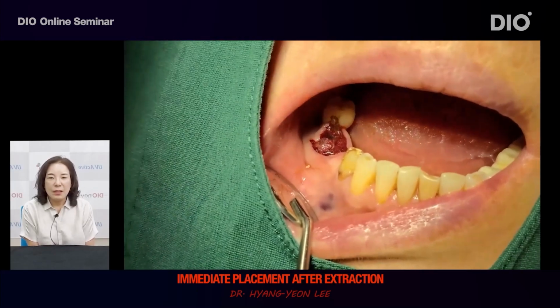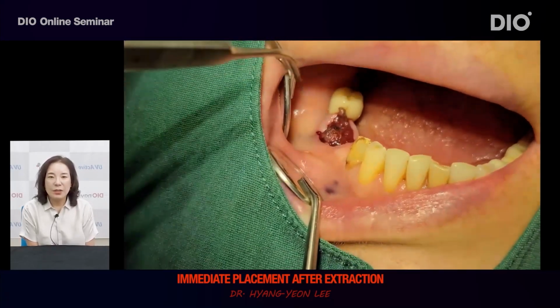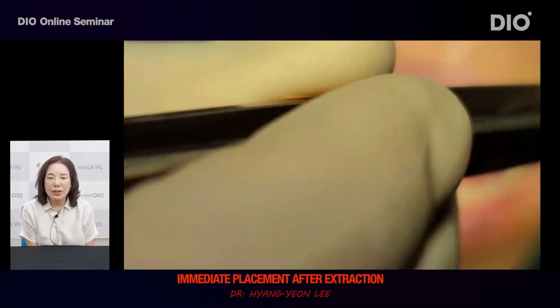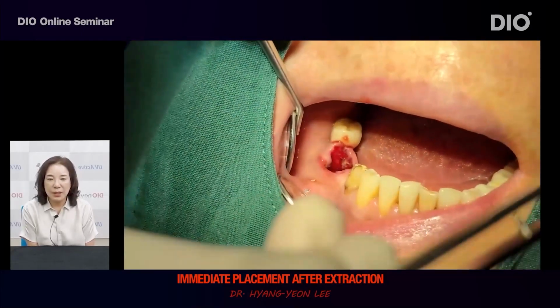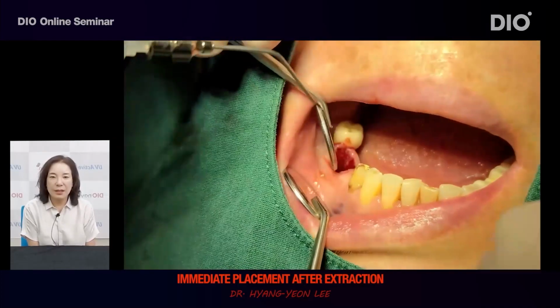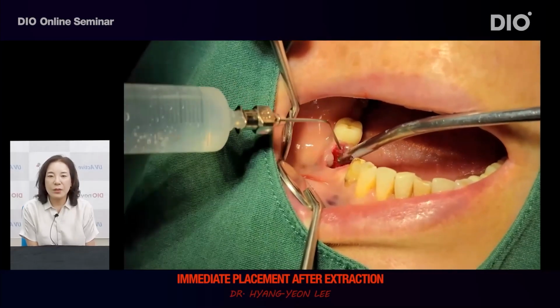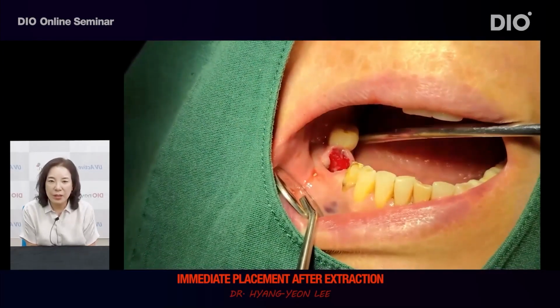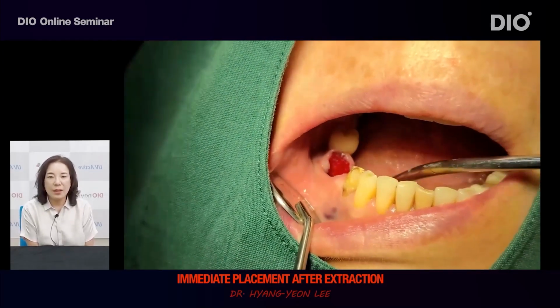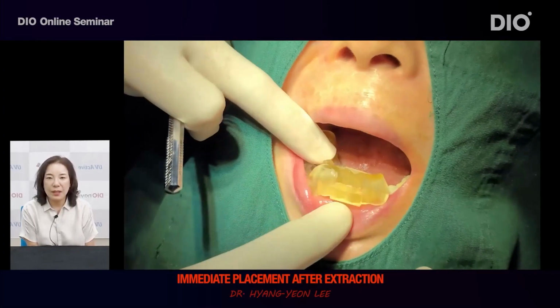Occasionally, when you put the doxycycline cotton balls in by rolling up smaller cotton balls, make sure to count the number of cottons to ensure that every cotton ball that has been placed in is definitely removed. Otherwise, doxycycline cotton remaining in the cavity can become a major problem. Accordingly, it is advisable to use a single large cotton ball as much as possible.